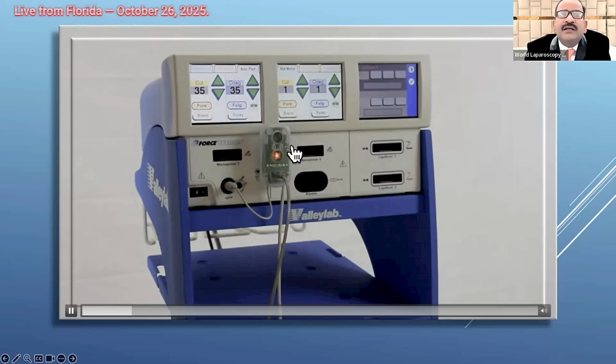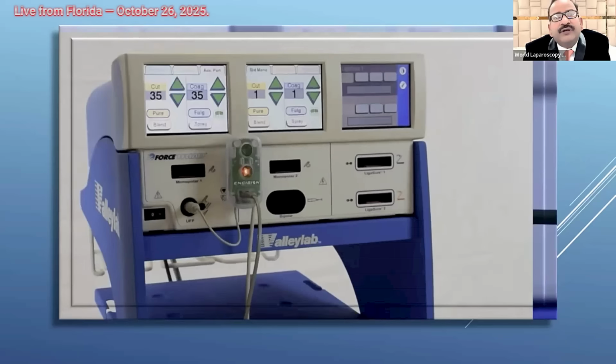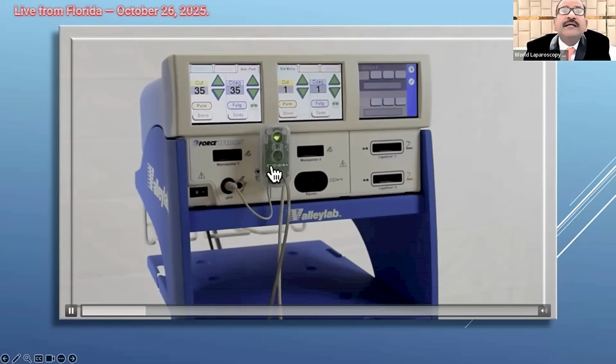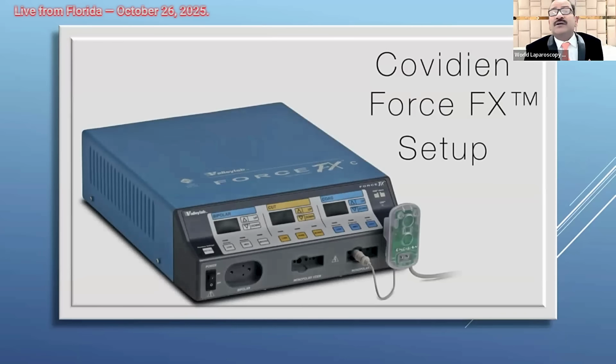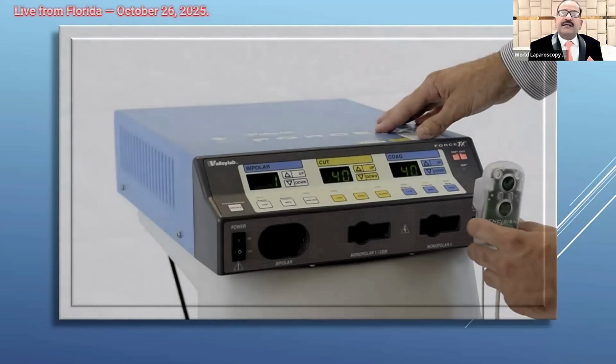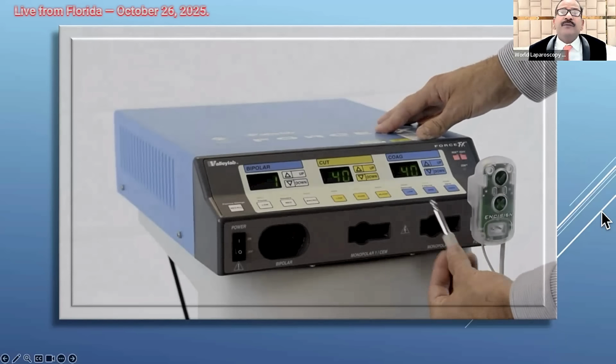If it is bad, it will give you red light. Suppose you are doing direct coupling, or there is any insulation failure, there will be a surge of current, and it will break the circuit. So basically it is used as a circuit breaker, like the miniaturized circuit breaker, the MCB, in our house, which trips whenever any fault is there. The same way, it will break the circuit. So it is called a burn protection system.